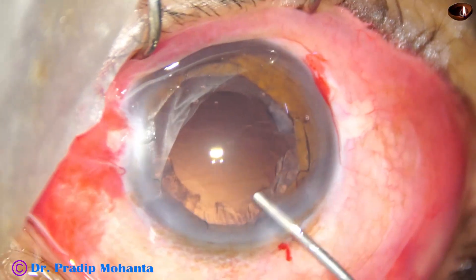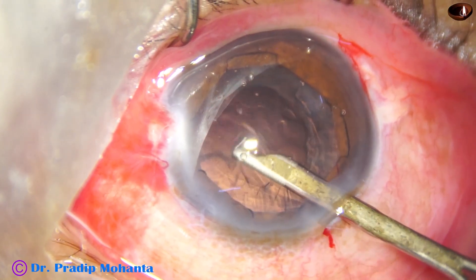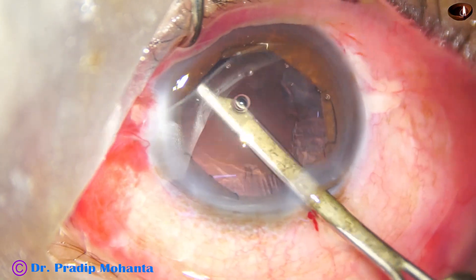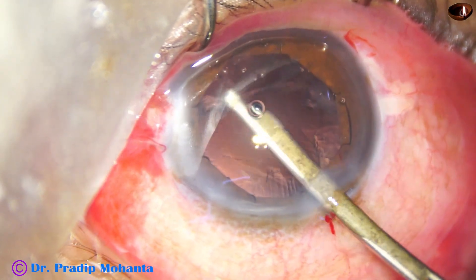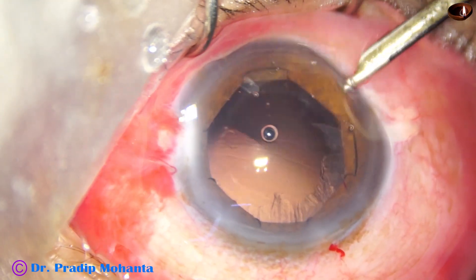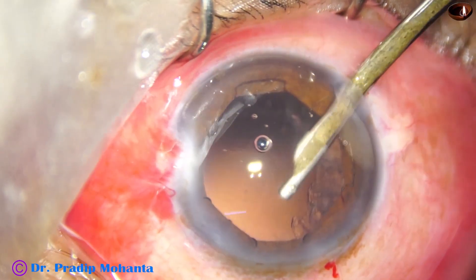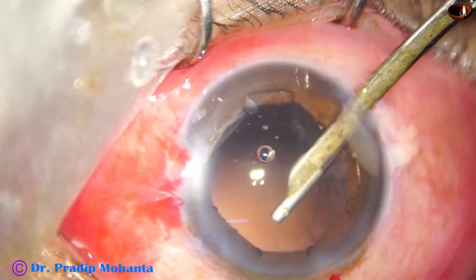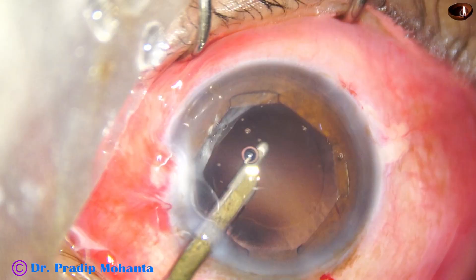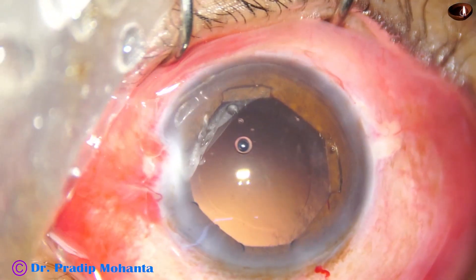Now is the time to remove the cortex. A Simcoe is a safe instrument in such cases — you get more control and can move it side to side gently to remove the cortex. In such cases, don't pull the cortex centrally; hold the cortex and use a tangential pull, moving side to side, to remove it. It takes some time to remove the cortex when a CTR is in place. However, the CTR must be placed early in surgery to support the bag; otherwise during emulsification, zonular dialysis can occur at any part of the capsular bag.